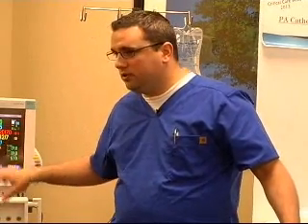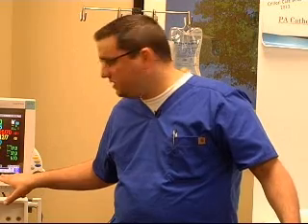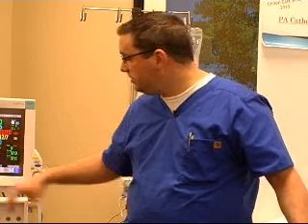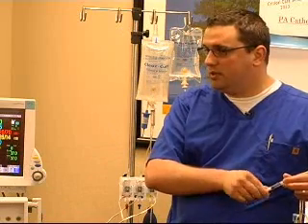Now again, just like with your cardiac output, you have to confirm this or you have to save it. This one actually is store wedge. So you have to hit store wedge. Otherwise, that does not go into the DAS system. Okay? And it doesn't pull it into the monitor. So once you've done that, hopefully it would have already gone back to a PA waveform. The demo doesn't show that. But you always want to confirm that once you've done your wedge that it's gone back to the PA waveform.